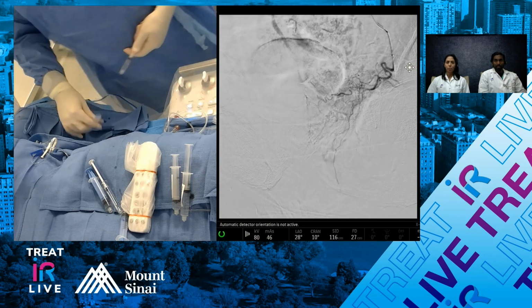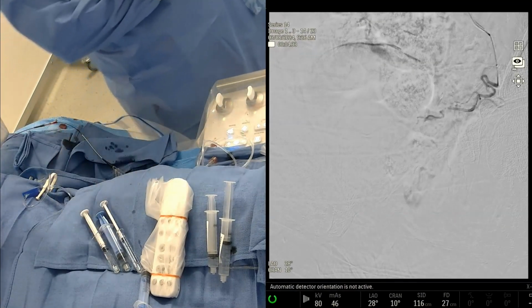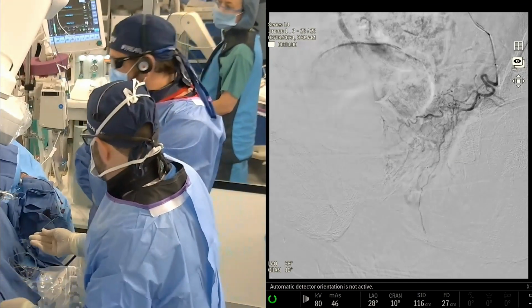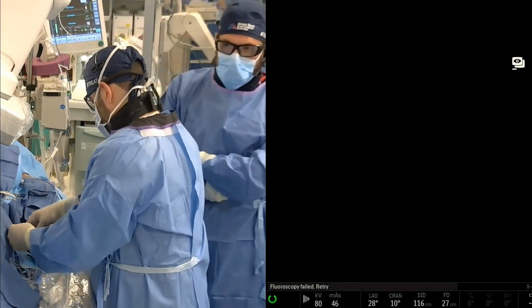We're going to go more distal. Let's grab that wire. Well, you want to be able to talk to them about all the different options. PAE is a great option for this patient, but not for everybody, obviously. We go over all the alternatives. His prostate's a little bit big for TURP, but there are people that would TURP this.